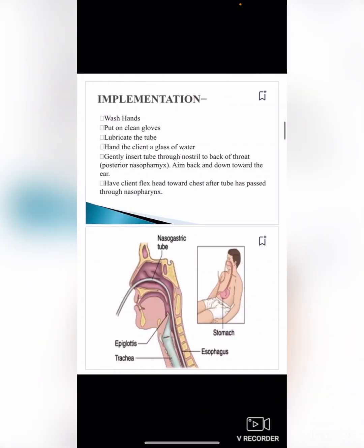Implementation: wash hands and put on clean gloves. Lubricate the tube and hand the client a glass of water. Gently insert the tube through the nostrils to the back of the throat, aiming back and down toward the ear. Have the client flex their head toward their chest after the tube has been passed through the nasopharynx.